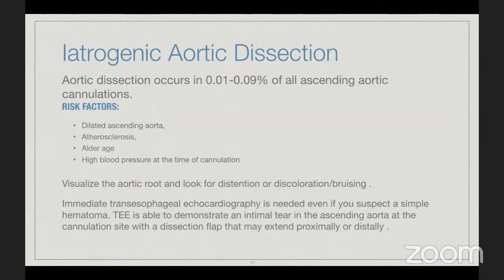What if the heart is arrested? Well, even though you are doing this in a circulatory arrest, this has to be done in a matter of minutes. So you are doing these things at the top while your assistant is already preparing the groin, and it should not take more than a few minutes to open emergently.